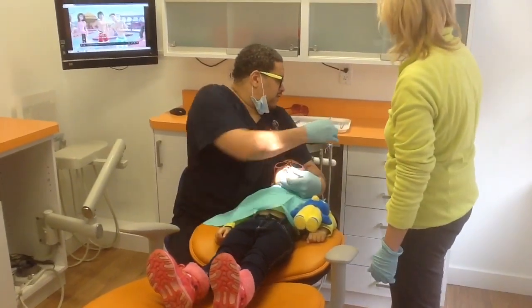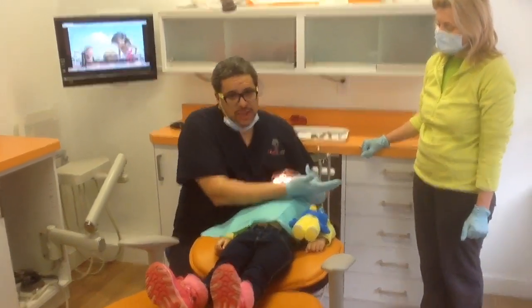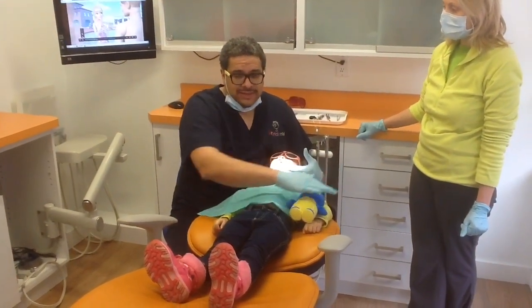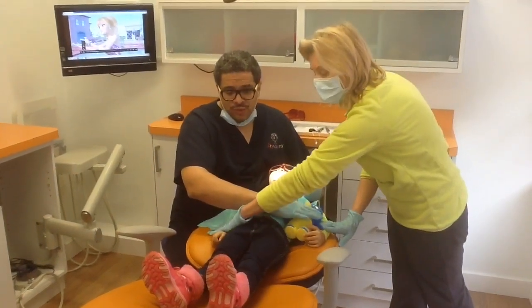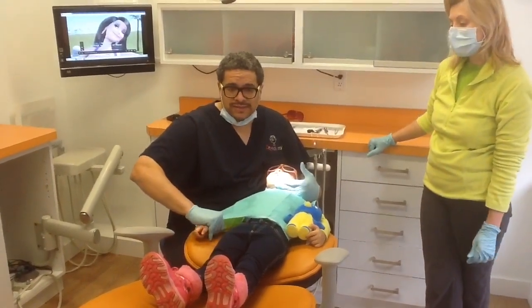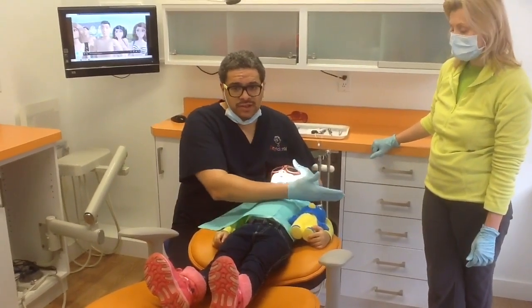So that's it in your review. Remember: you want to have a clear field, keep the patient's chin up in a gentle position, and bring from underneath so your arm can also act as a guard if the patient's uncooperative. The assistant comes over and does passive restraint — she covers the arms. If the kids move, she can switch to protective restraint where she actually gently holds the wrist. Remember, we're not squeezing and we're not pinching. Very often kids can get bruised or suffer broken bones, so you want to do everything very slowly.